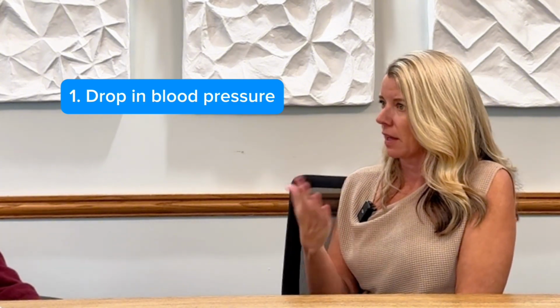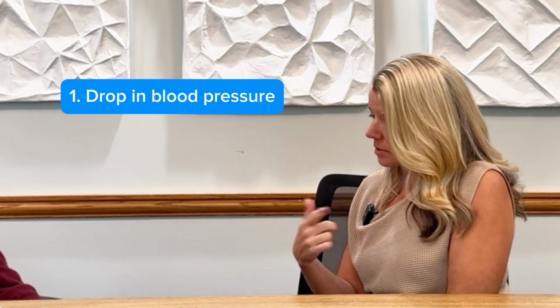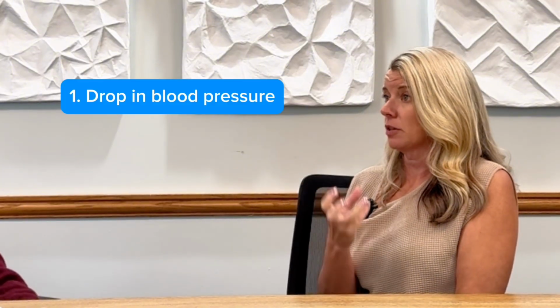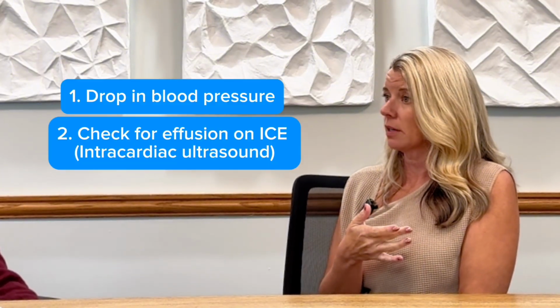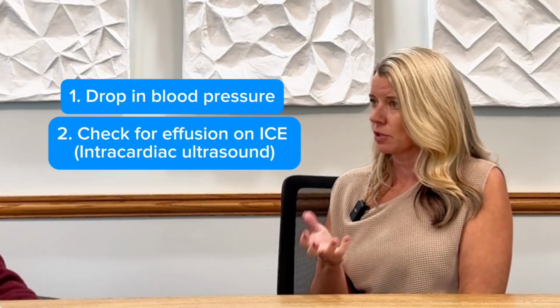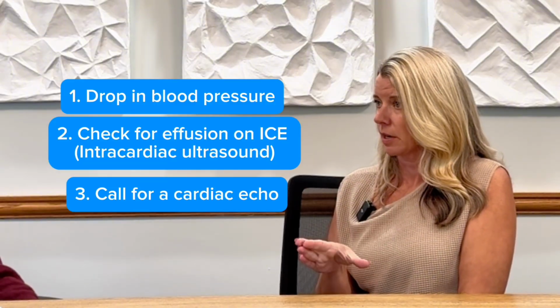If they suspect that, then that's the first thing they're going to do. Then they'll call for stat echo. Then we'll be recycling the BP, blah, blah, blah. If you're doing a transeptal puncture, you already have the intracardiac echo ultrasound in there, and so they can kind of move it around and take a look. They will typically still want to have an echo to confirm before we do pericardiocentesis.